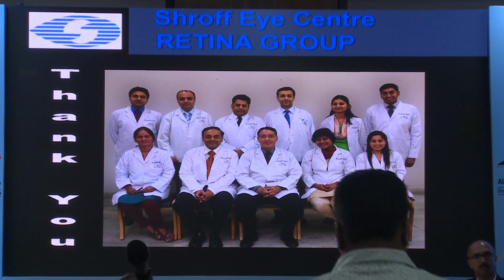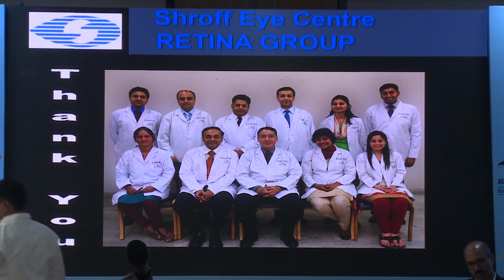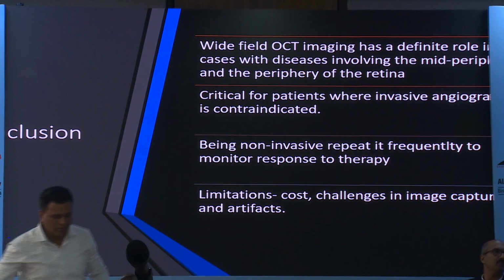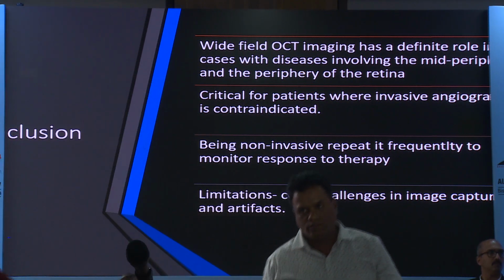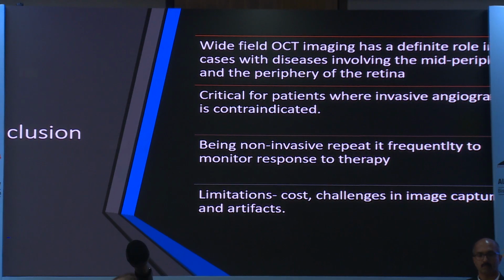Thank you, Darius. And by the time Prashant, the next speaker, puts the slides on, both OCT and OCTA, do you think one day we'll give up all the angiography, the regular ICG and FFA? I think maybe one day, but not yet, because you cannot see the leakage. That's the main problem. You can see the flow, but you can't really see leakage using this technique. So that's the contraindication.